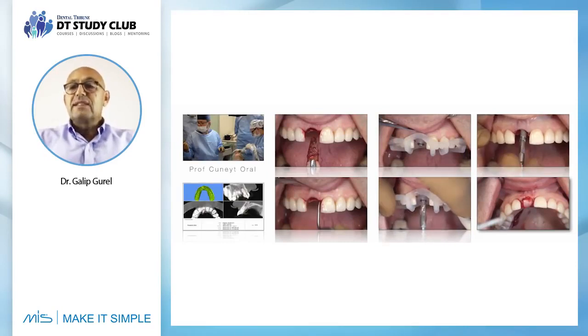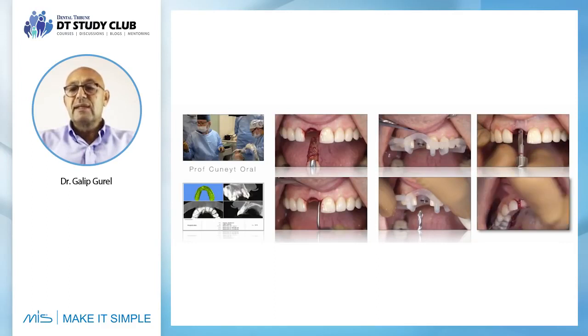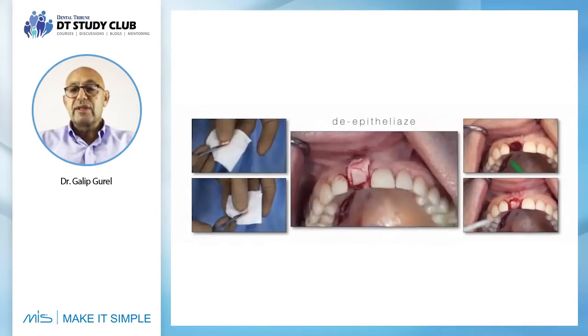And again, we're placing the implant, and on the right bottom you can see he is covering up the extraction socket. For some reason we didn't want to load this implant, but rather leave it like this. What he is doing in the right bottom corner is taking this connective tissue graft from this premolar zone, and then he is de-epithelializing a part of it.